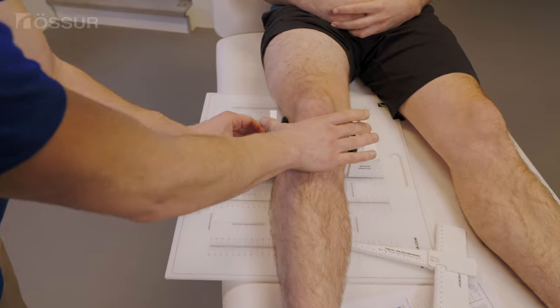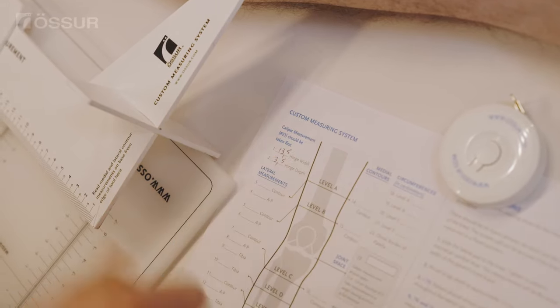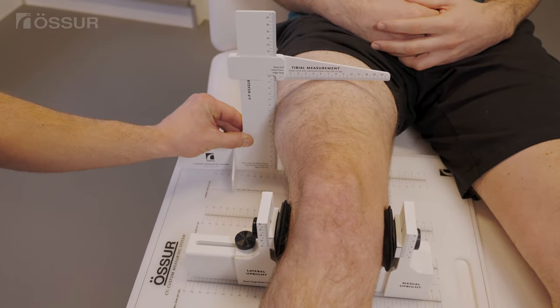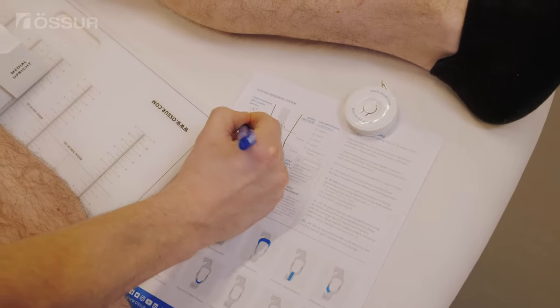Every CTI or CTI OA custom knee brace is manufactured to exactly match a user's unique anatomy and requirements. Measurements can be taken using the CMS, smart measure, or a 3D scan. You can also supply a patient cast.